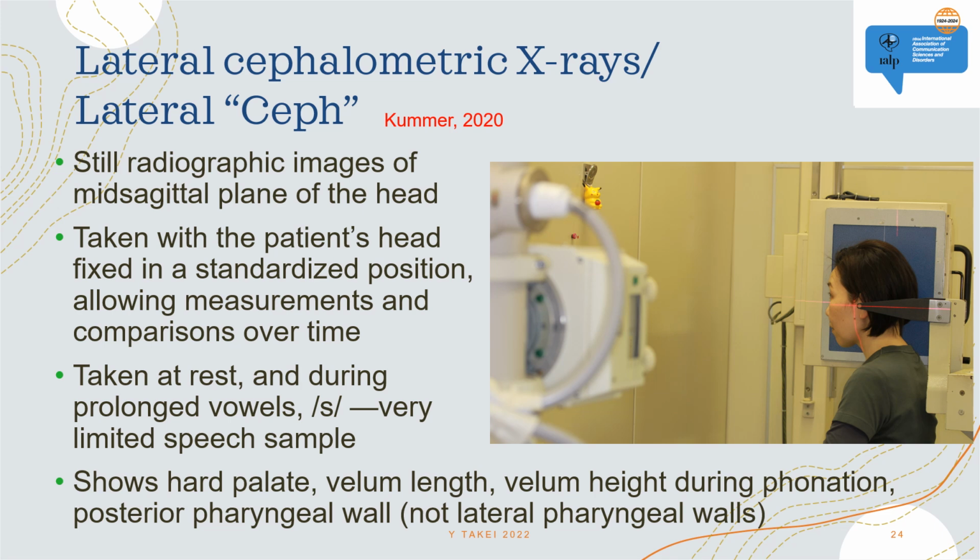Lateral ceph can be taken during the phonation of vowels or production of a prolonged S. Because it is a still image, the sounds to be tested must be continuous sounds, so the suitable speech samples may be very limited. The lateral ceph shows hard palate, velum length, velum height during phonation, and posterior pharyngeal wall, but lateral pharyngeal wall cannot be viewed.